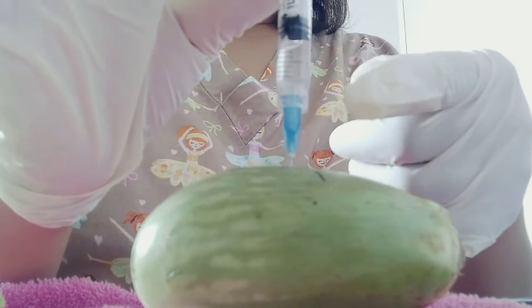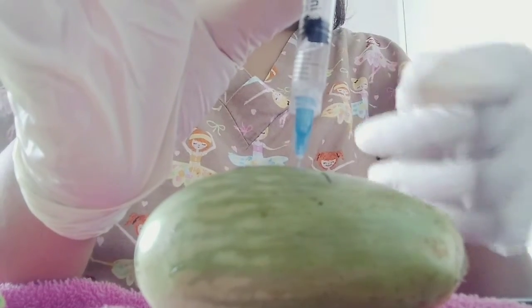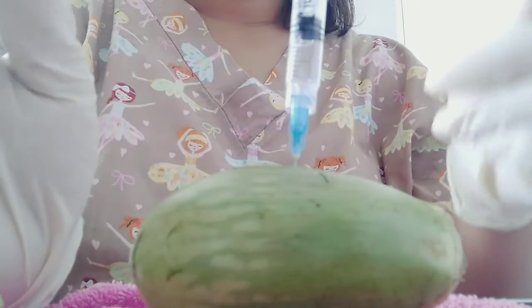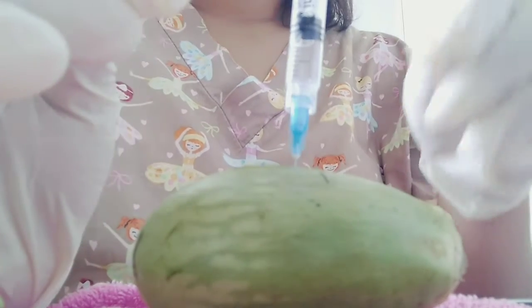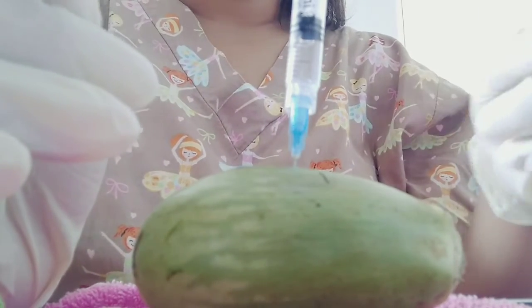If blood appears, it means you have hit a blood vessel. Remove and discard the needle, and you are going to start over.